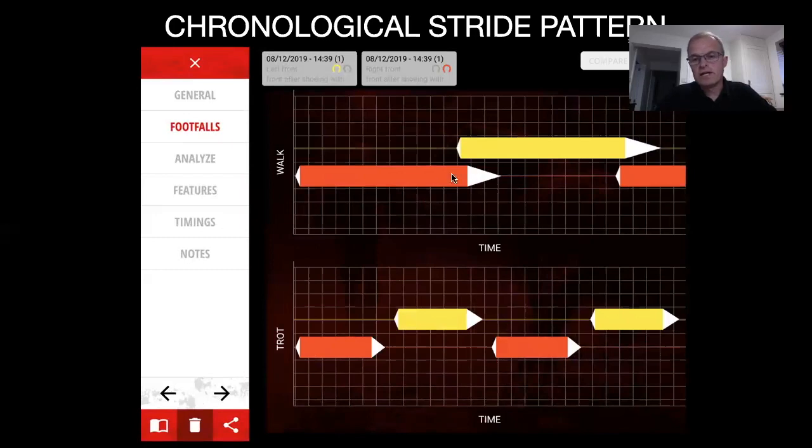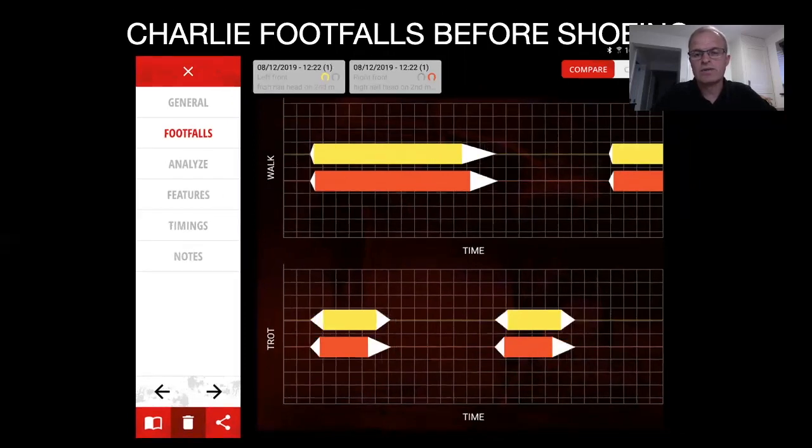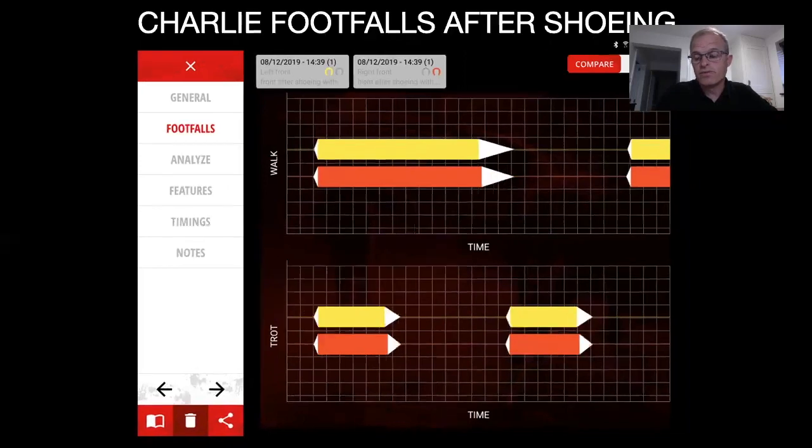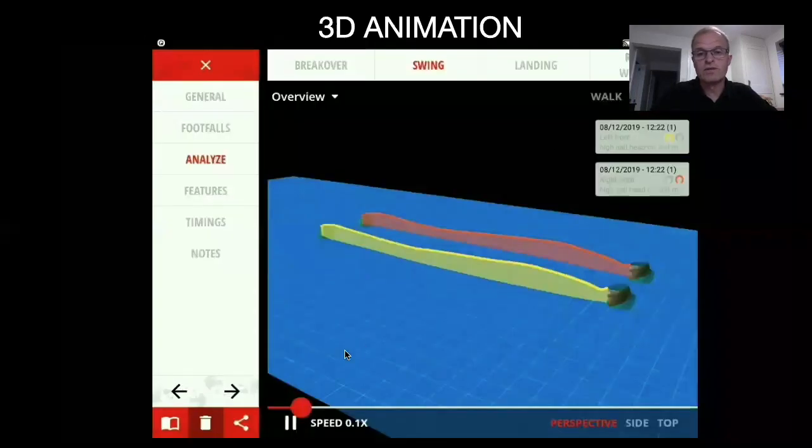So as I said, in footfalls we can look at the chronological stride pattern in walk and trot, and this is a real good go-to. When you've just measured a horse, you can look at the stride pattern and look at the asymmetry. Is this good at identifying lameness or characterizing lameness? Yes, I know that I've measured a lot of lame horses with Werkman, and these are often the results I see. So this is in a chronological order, so we'll skip through.